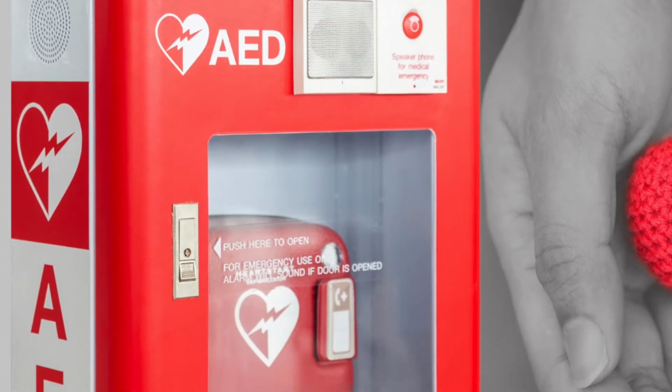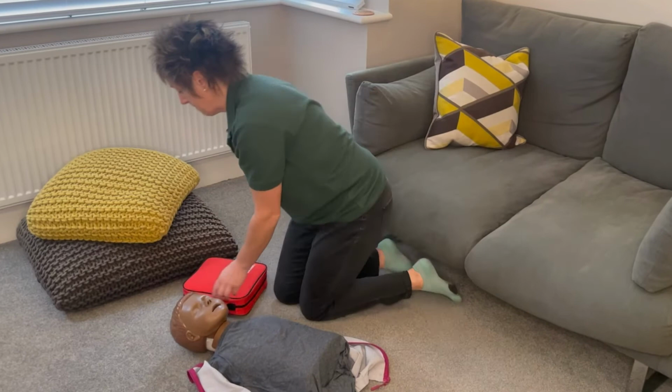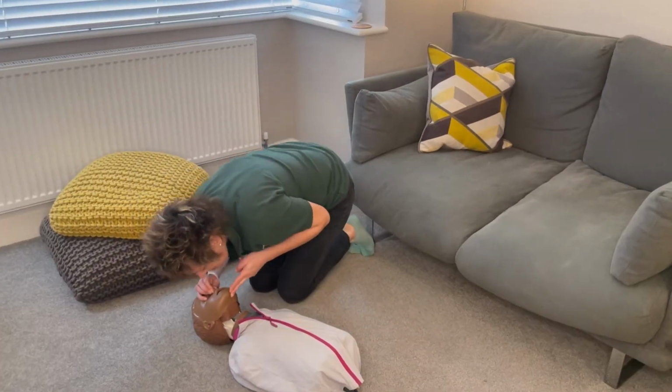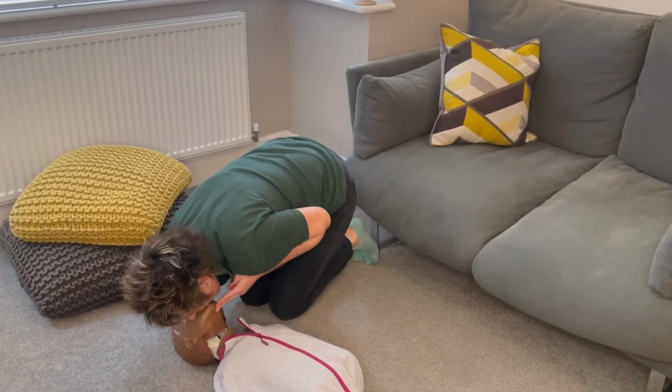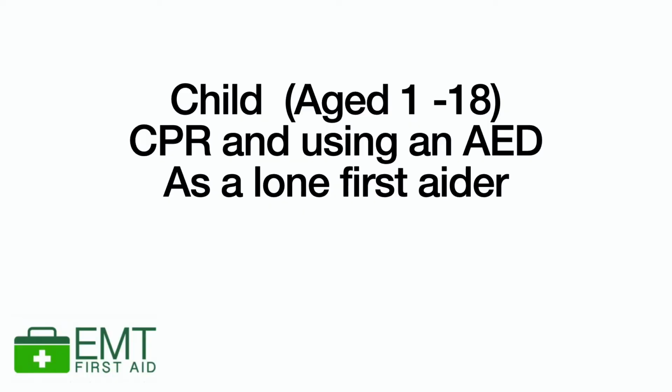So let's talk about using an AED, a defibrillator, on a child or smaller frame person. We're going to recap child CPR and then we'll show you how to introduce the AED if we're a sole rescuer. So watch all the way through to the end.